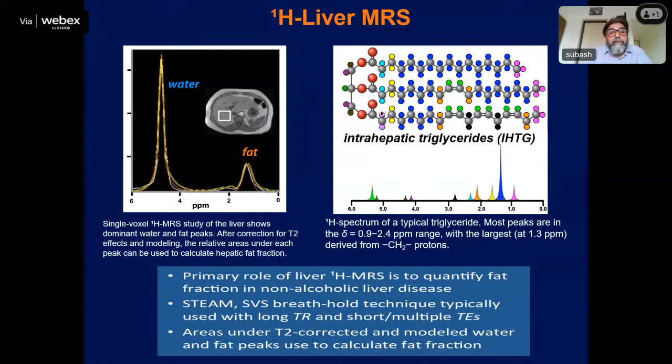So this is another technique where you can show fat deposits in the liver. If the person does some exercise and reduces weight, then you can see how this fat-water ratio will come down, because the fat is now being utilized and converted into energy.